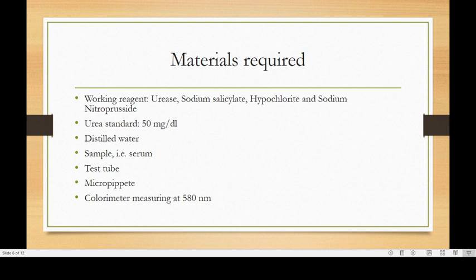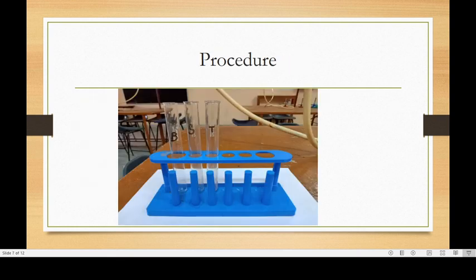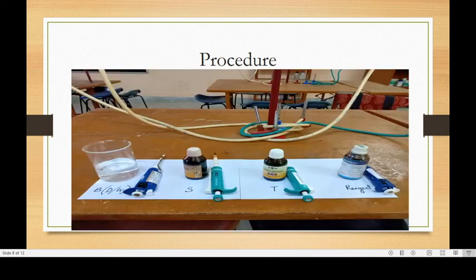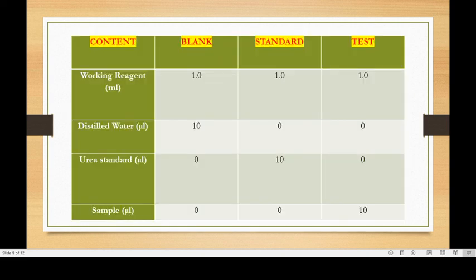For the procedure, first take three test tubes and mark them as B for blank, S for standard, and T for test. Take distilled water as blank in a beaker, then the standard urea solution, the sample, and the reagent. Also take different micropipettes to pipette out all these reagents.